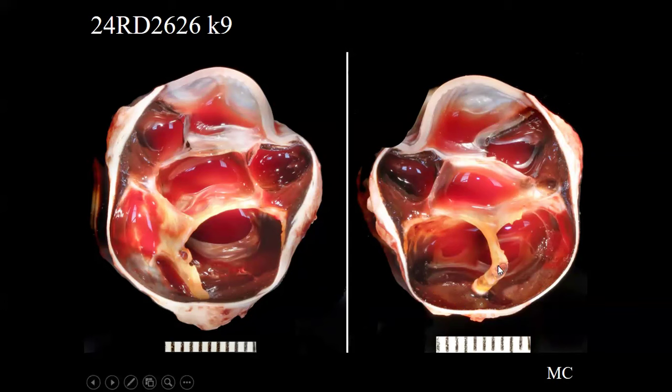And as you may have noticed, there's this little brownish sort of oval in cross-section thing here. And it's tacked straight through the retina. And in this other half, we can kind of see it passing underneath the semi-opaque retina and into the sclera here. So this was a linear foreign body that was pinned through the retina and extending through the posterior sclera as well.